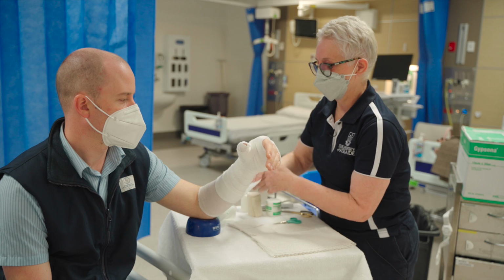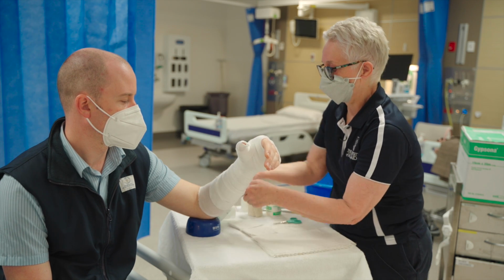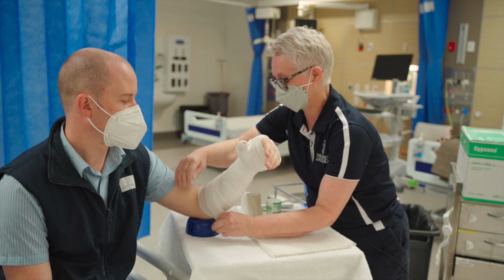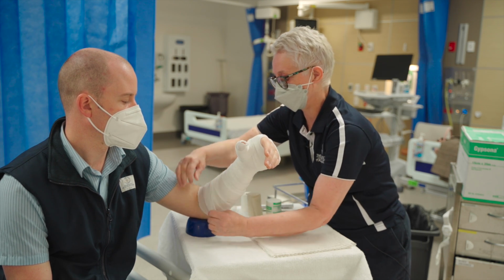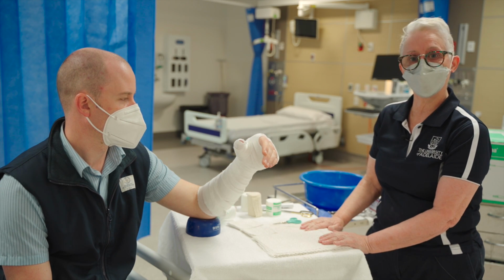So we do almost like a 50-50 wrap, not quite, just work it so that you are overlapping some of it. The arm is not a complete cylinder, so it's pretty hard to get a 50-50 wrap, and there's 2 wraps around the bottom. So that's what we're looking for there.